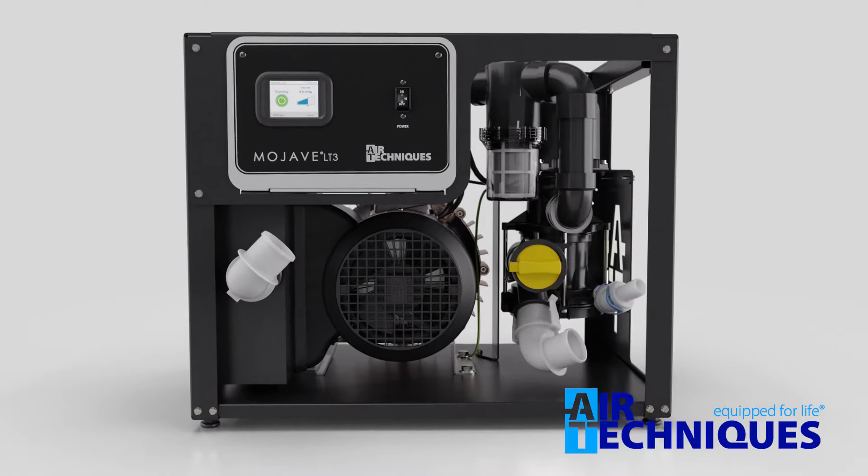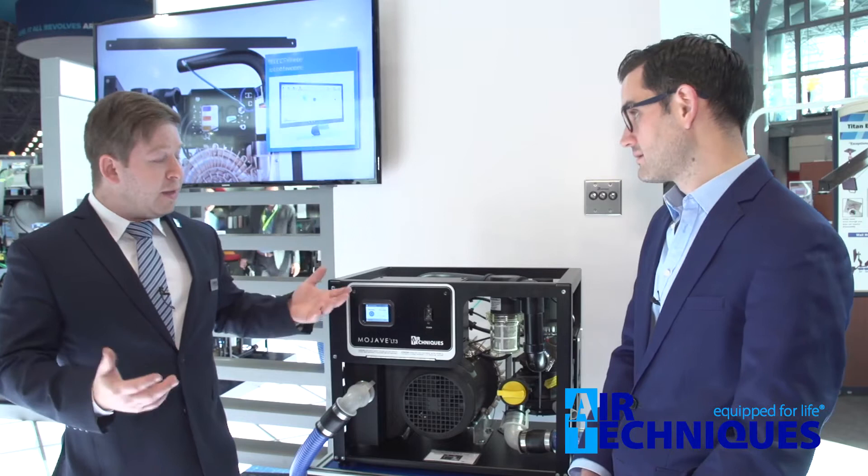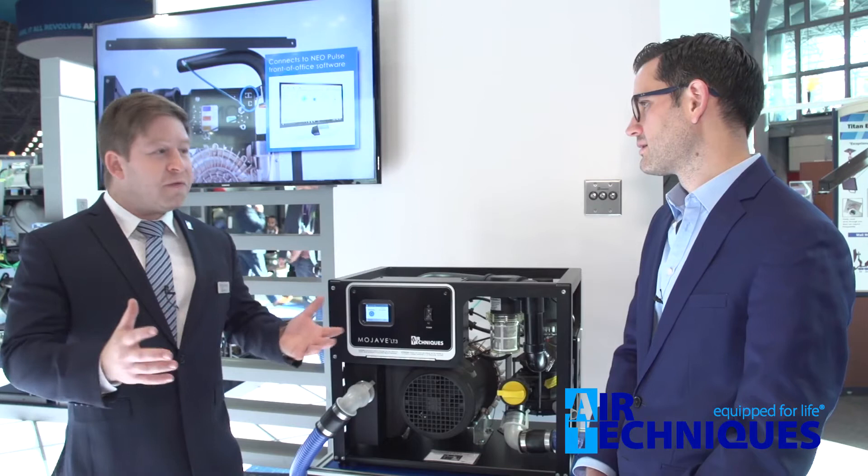What the variable frequency drive does is slow the air pump down and speed it up based on demand. So as more HVEs come online, the system is going to react directly to them, making sure that there's enough negative pressure for however many doctors are using it at one time.